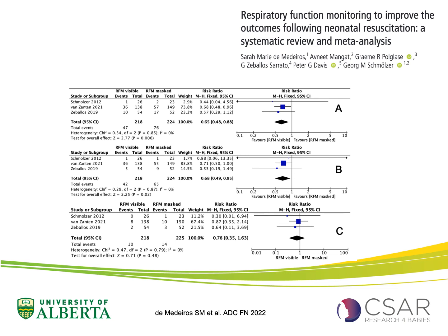The background for that is that more and more animal studies, as well as a couple of human observational studies, have shown that when you deliver high tidal volume, you can have a fourfold increase in brain injury in those extremely premature babies. So maybe the respiratory function monitor is not so much about reducing BPD or ventilator-induced lung injury. Maybe it's more a tool in the future where we can help to reduce brain injury, which would be as exciting as using it for reducing lung injury.